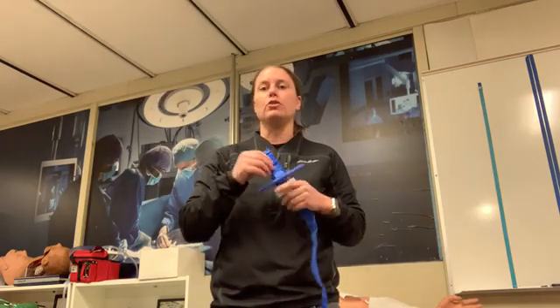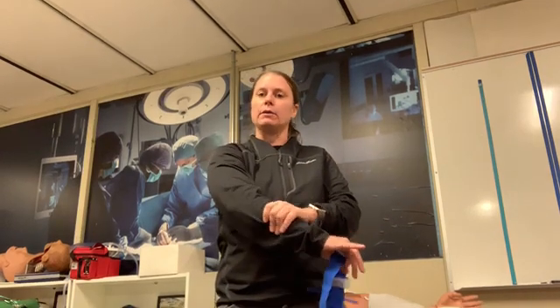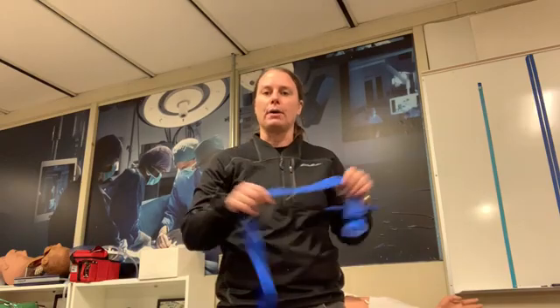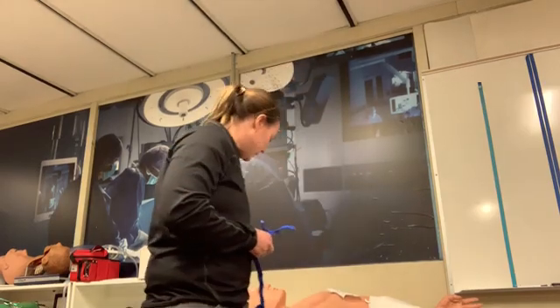And so sometimes you can use more than one. So if I put this one down too low and I couldn't really get it tight, I could put another one on above. And so I like to go ahead and put these on high and tight right away. So you can go ahead and then put this on.